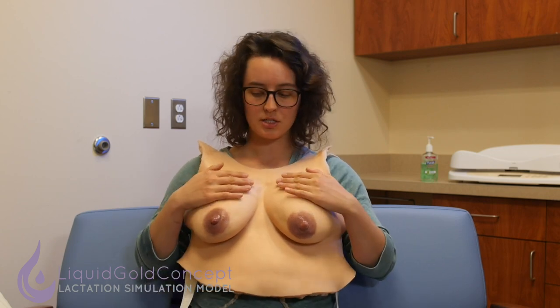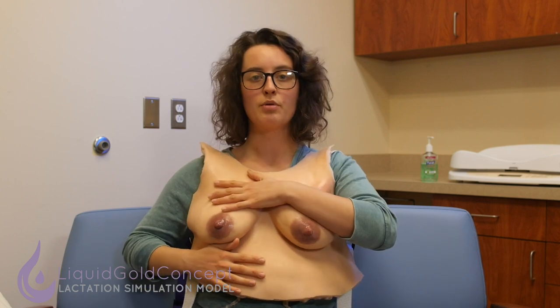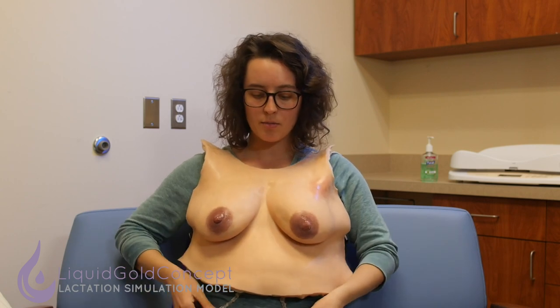You really just need to do a focused breast exam. You're not going to find any abnormalities, so just ignore the red discoloration of the breast — this patient does not have mastitis. The nipples are normal, there's no fissures, no bleeding. You want to practice correct examination, and remember you do not need to engorge for this case.